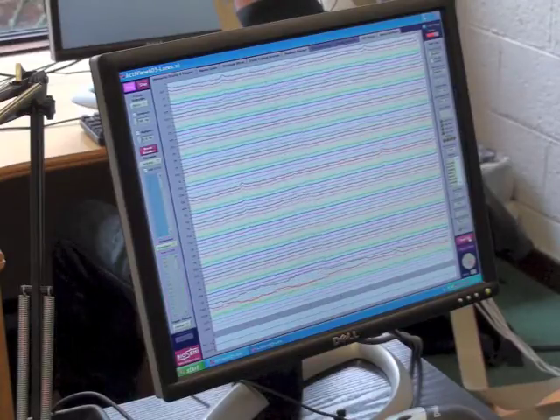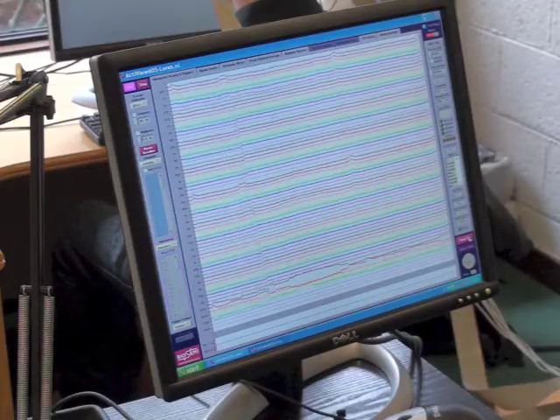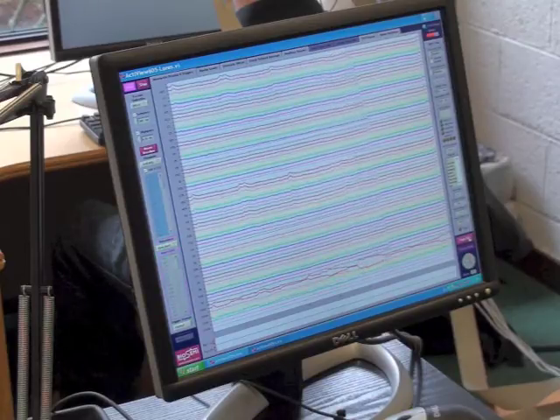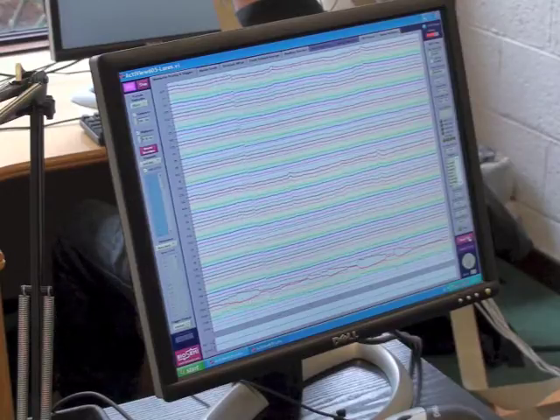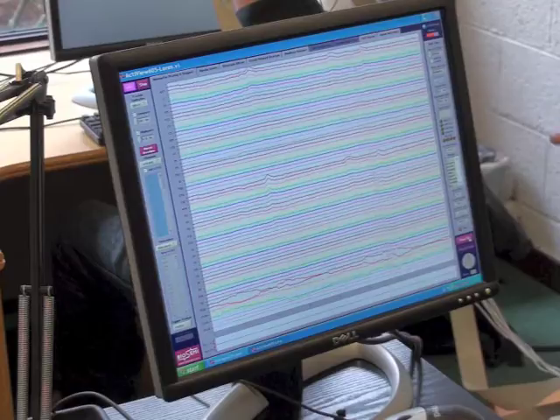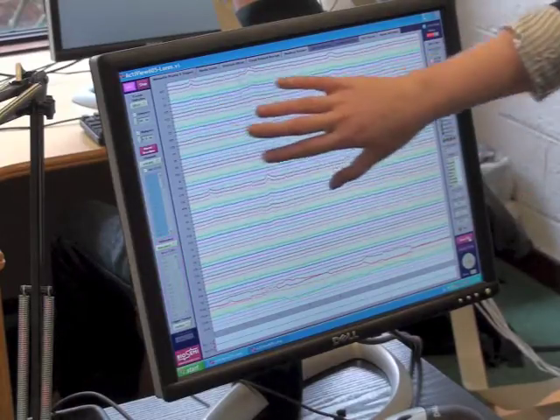Okay, so that's it. There's a couple more general tips I have before I stop you. Sorry, Brendan. The legs crossed. I said that wooden chair and table is really important. The more metal you have in the table and chair, the more likely you are to get interference. And this is fine interference. I know that this is just 50 hertz interference, but I've recorded and it's just crazy across the screen. It doesn't mean anything.